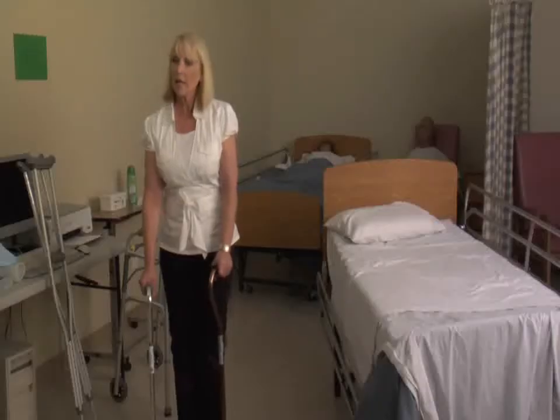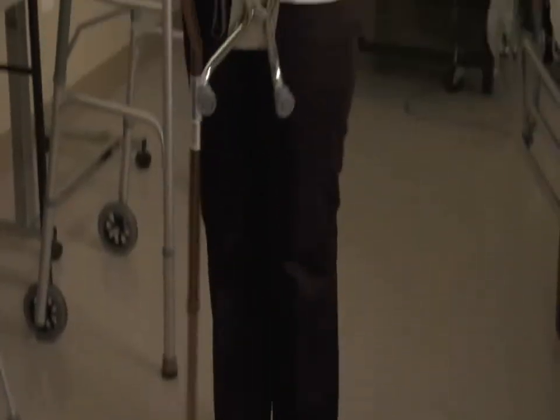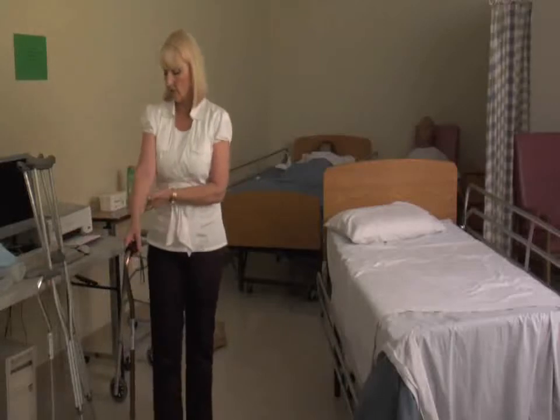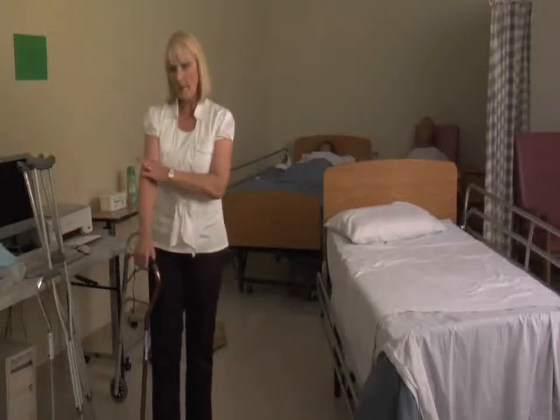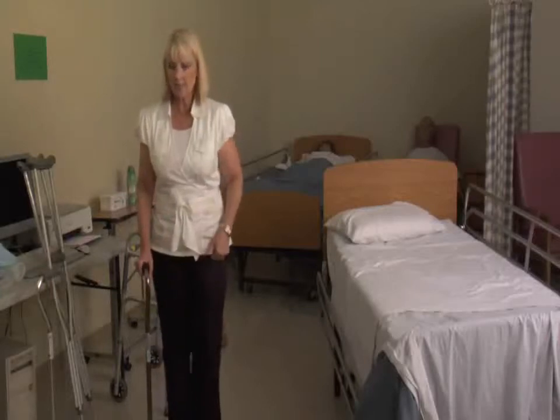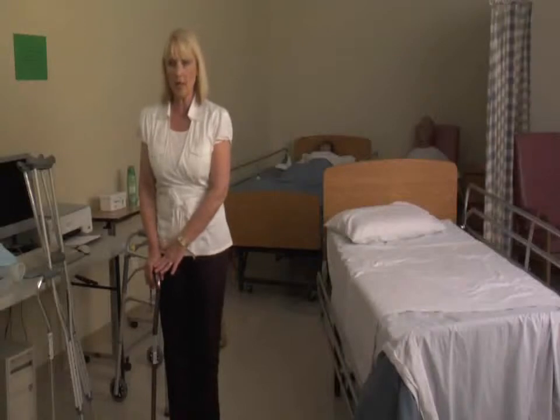And there's different kinds of canes. We have just a regular cane here. This is called a quad cane. It has 4 legs. There are also canes that have a little rest for the elbow that come up the arm. But the main purpose of the cane is just to help and assist the patient when they're walking. We always hold a cane on the strong side.